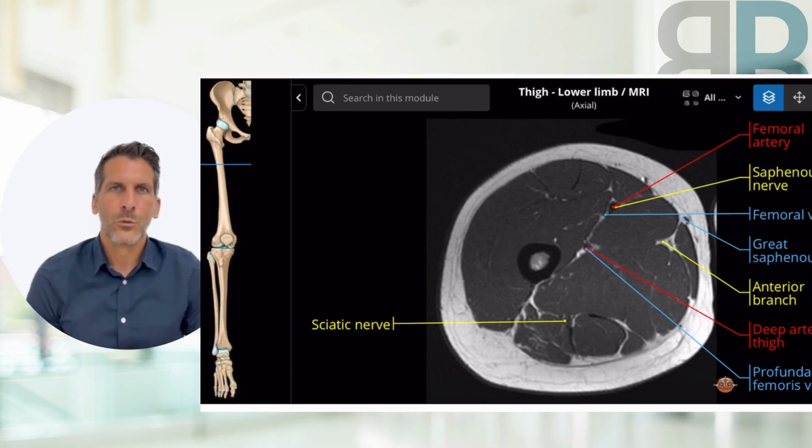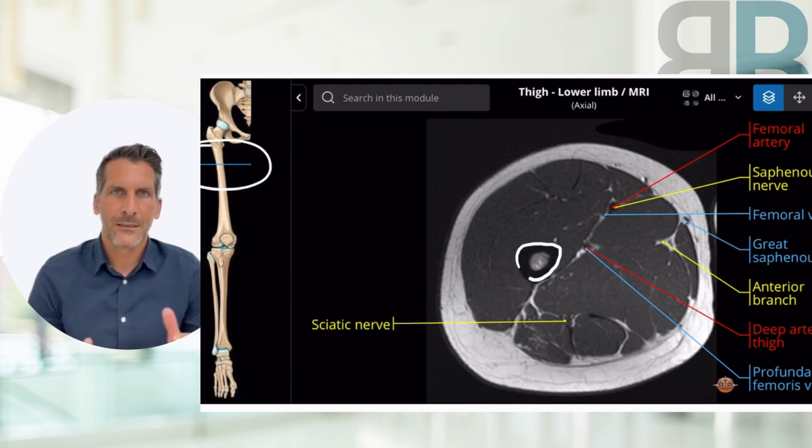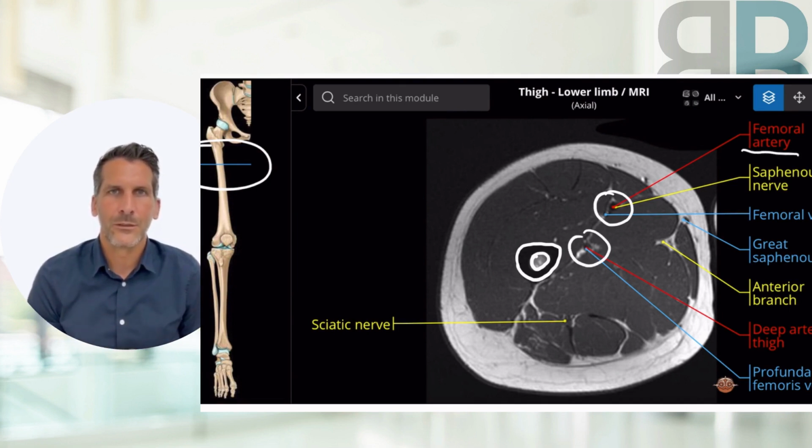The major problem or the major risk associated with this procedure is as follows. Here, I will show you a cross-section of the thigh at the cutting height. You can clearly see the femur and its medullary cavity. This is located centrally in the thigh area. Additionally, the adjacent important structures, arteries, veins, and vessels are marked.